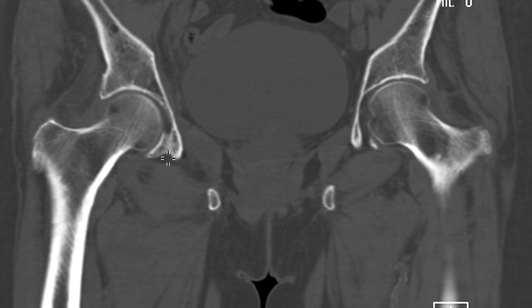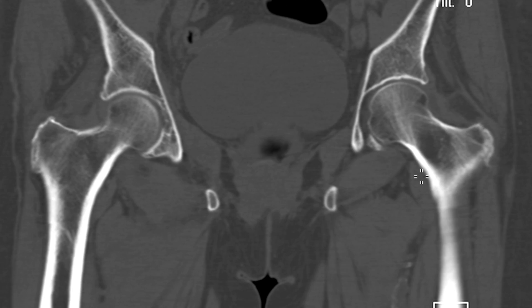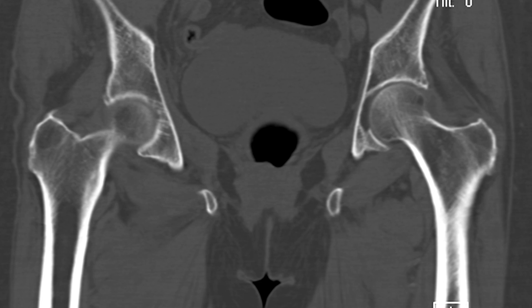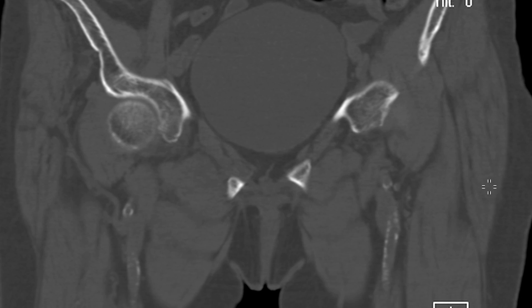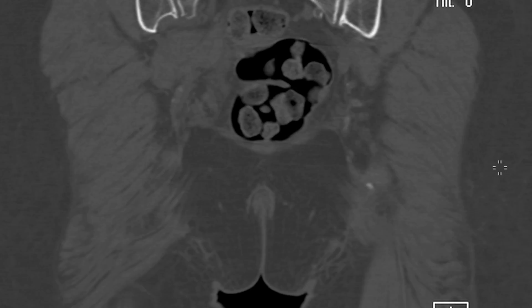That's the anterior wall of the acetabular fracture. We're always looking at the femoral heads and femoral neck — in this case we didn't see any fractures. However, if there's strong suspicion for an underlying hip fracture, even a negative CT scan should not be the endpoint. If the patient continues to be symptomatic in the presence of a negative CT, we should pursue an MRI to make the diagnosis — whether it's an insufficiency fracture or some other type of trauma, the MRI evaluation is going to be more sensitive.